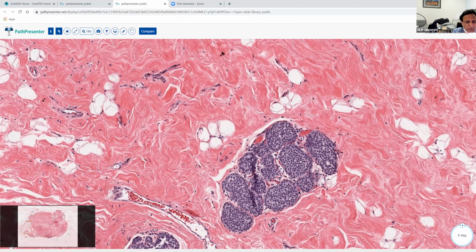Nowadays we don't make much of a big deal about it, unless you are thinking about something like pleomorphic LCIS or florid LCIS. That is the so-called special type. But between type A and type B, at least at Memorial, we don't make that discrimination.